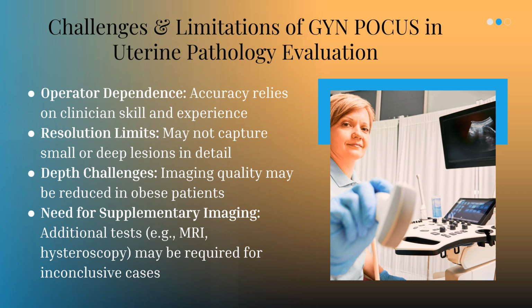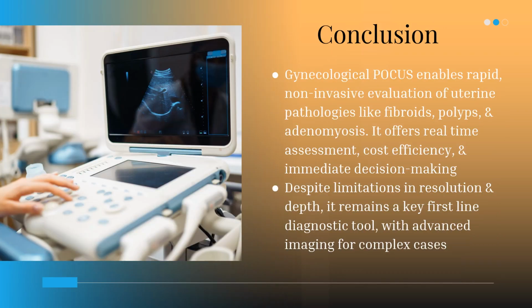Doing transvaginal is better than transabdominal when it comes to gynecological conditions, as are the quality of the machine you're using and the patient's discomfort. I mean, you may be better off just ordering the MRI if they're having significant pain. When you try to do a transvaginal ultrasound, you always have to look at that risk-benefit analysis. Especially with more obese patients, there's just extra tissue you're trying to look through with the probe to get to the organs you're trying to assess.